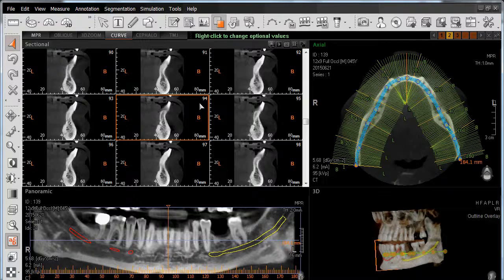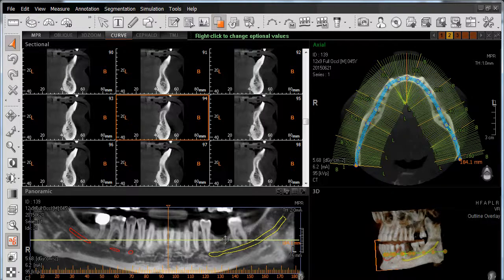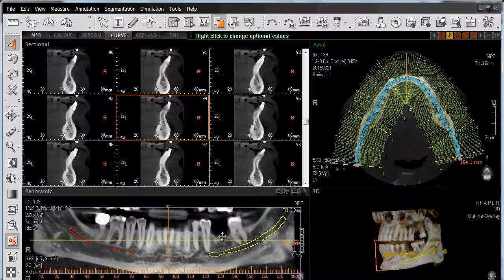From the 3D software, we'll continue working in our curve window. In this case, we're going to identify the site to place our virtual implant — site number 19 according to U.S. tooth numbers, and site number 36 using the Canadian tooth numbering system.